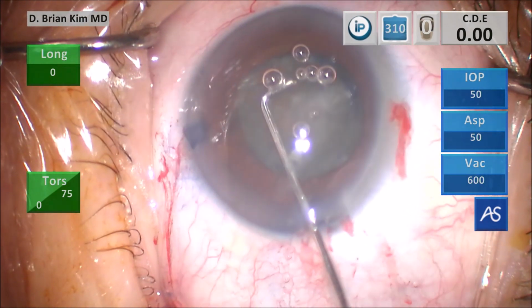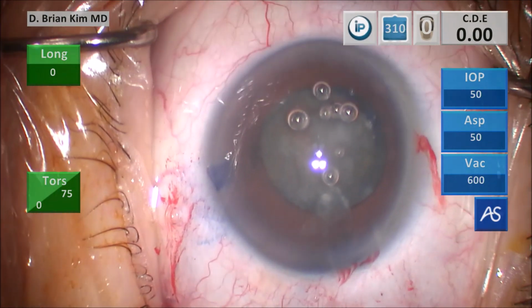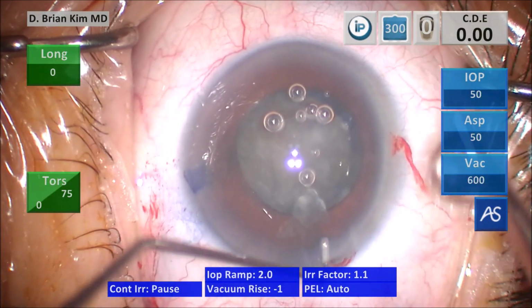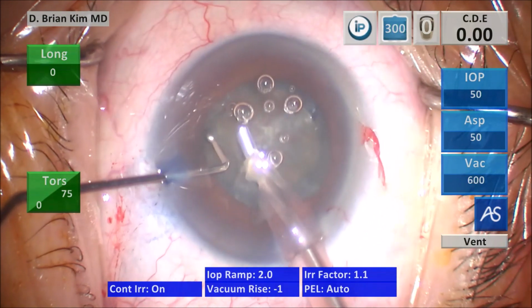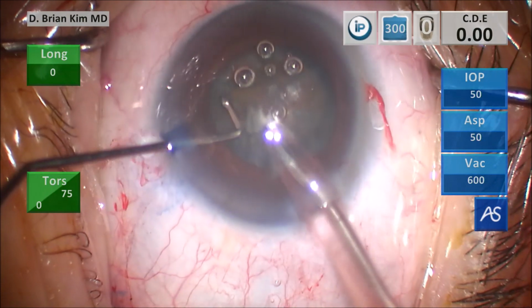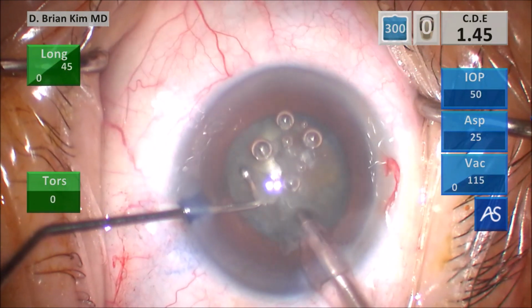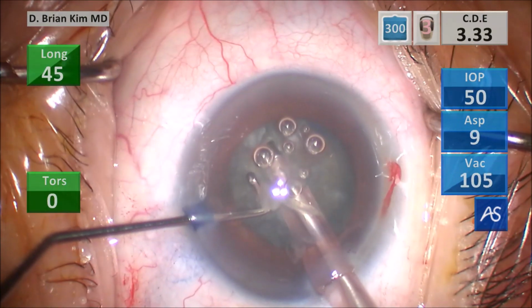But at the same time, I thought to myself, go ahead and leave those bubbles in there. And so this is the way you know. Because remember, viscoelastic and coating of the cornea is difficult to tell. Why? Because the viscoelastic is invisible. So unless you just keep pushing viscoelastic throughout the case, which is inefficient, a total waste of money, and impractical, it's really hard to know. The only way to know is really to have bubbles that are trapping the viscoelastic. So the way you know is making sure your viscoelastic has bubbles trapped in it. And so this is going to be my litmus test as to if I'm getting good corneal coating throughout the entire case.